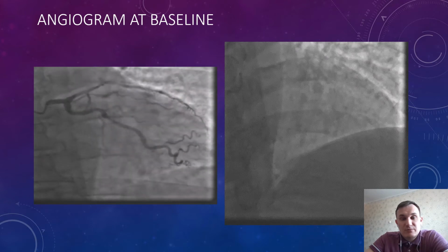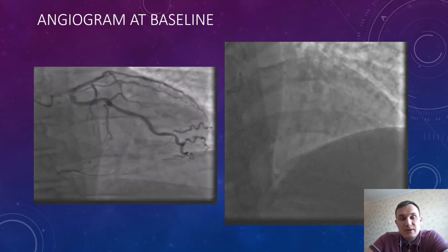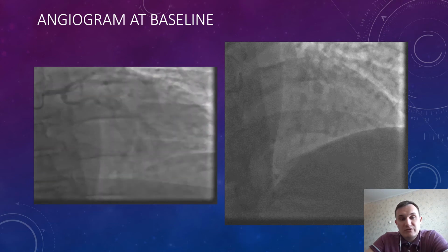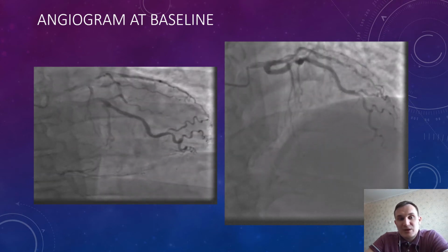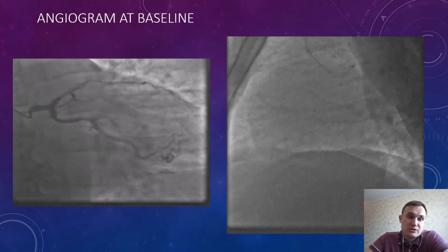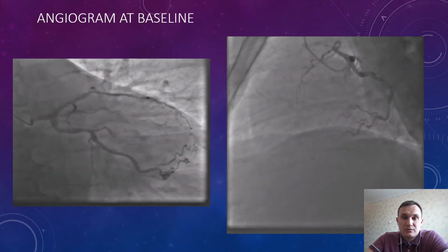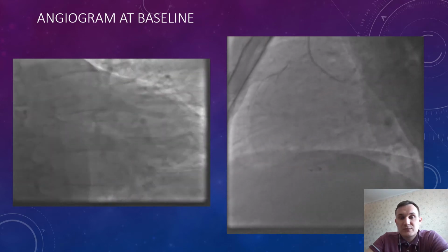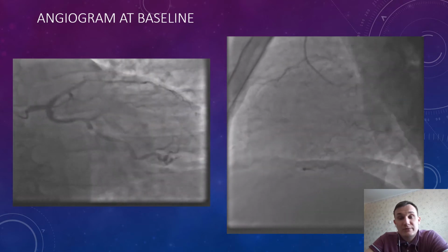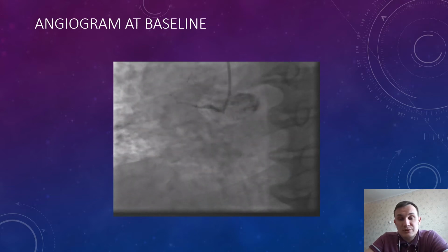If you look at the basal angiogram, you can see different lesions in different arteries: a subtotal lesion in LAD, ostial lesion of left main, occluded RCA, and some kind of lesion in circumflex. You can see different projections to assess the complexity. Lateral projection as well is showing us the moderately impaired flow in LAD and proximally occluded RCA as well.